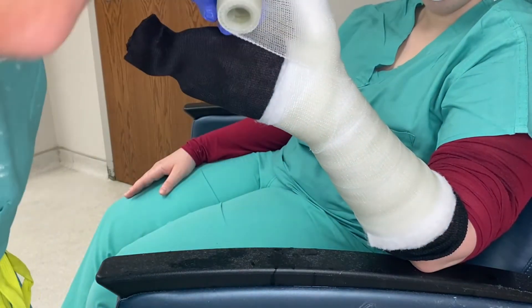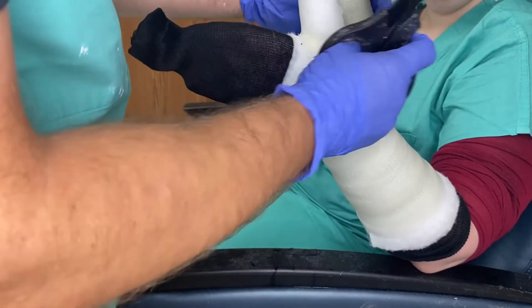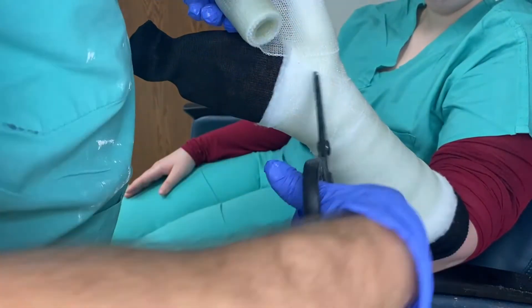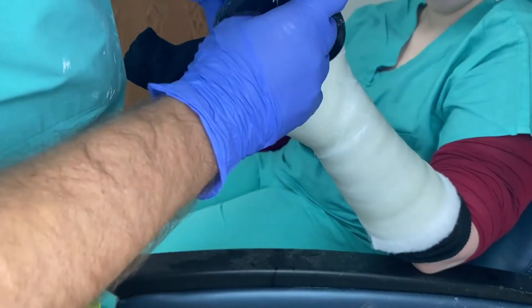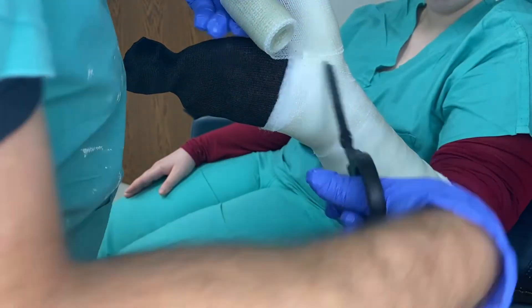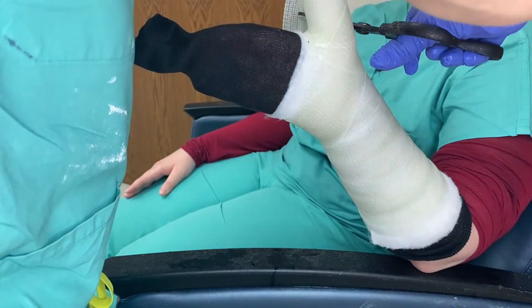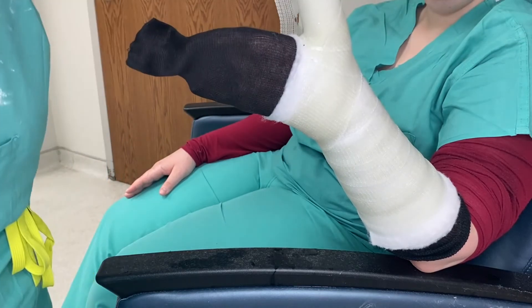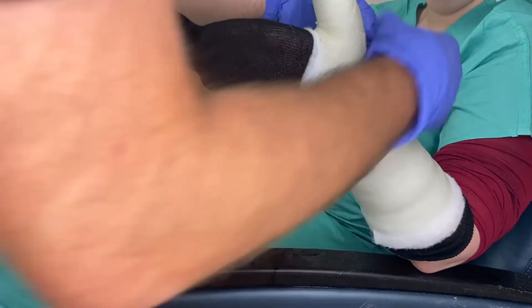Go around the hand again, then go to the thumb. Come up and do three layers — do a quarter cut or an inch cut, however much space you need. Once you get your nice three layers, come back around the hand. Do another half-inch cut and then go around the thumb again. Go around the hand again and do 50-50 from there down.